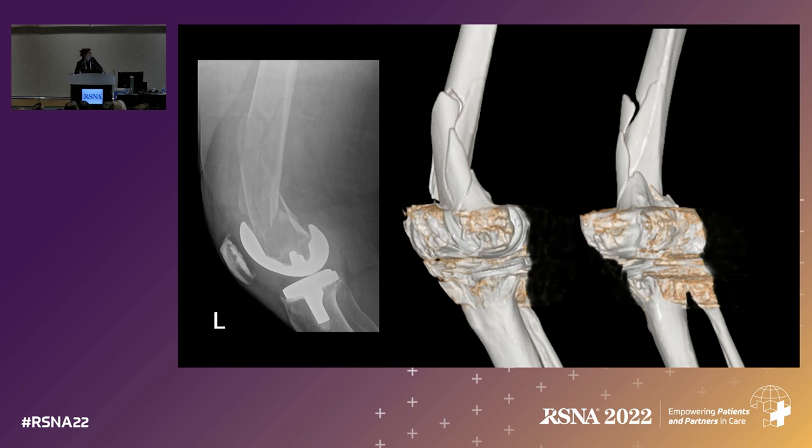I do apologize for these very ugly 3Ds, but this is what you get when they come right off the scanner. This is just what you get in real life, so it's a good representation. So we've got a very comminuted fracture here, coming down pretty low, but maybe this is okay.